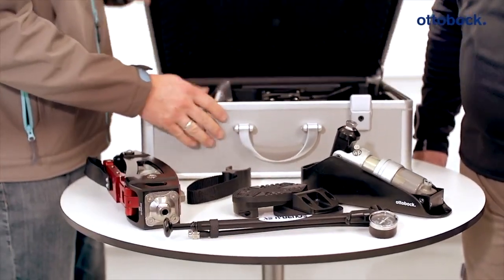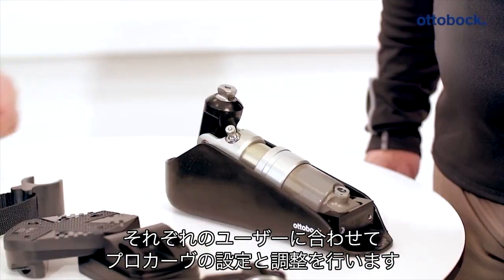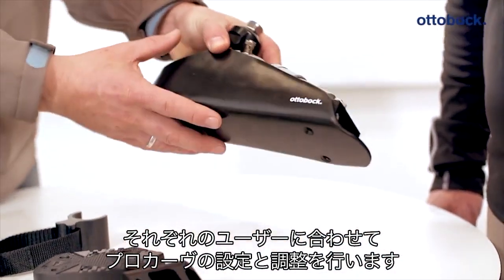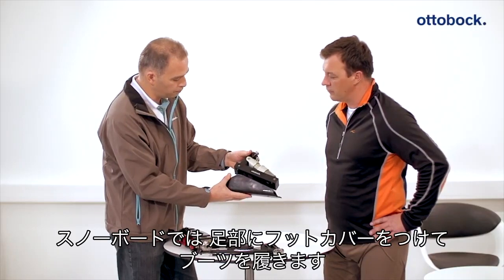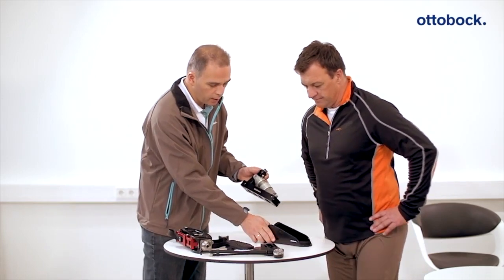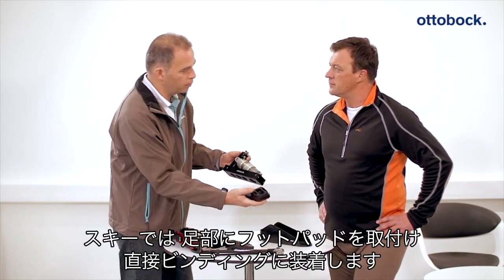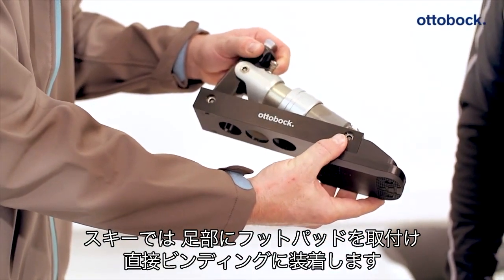The ProCarve prosthesis is individually adjusted during the trial fitting. During this fitting, all parameters are adjusted according to the requirements and abilities of the user. The foot component can be equipped either with a foot shell with a fit particularly suited to snowboard boots, or with screw-on pads that make it possible to step directly into the ski bindings without a ski boot.